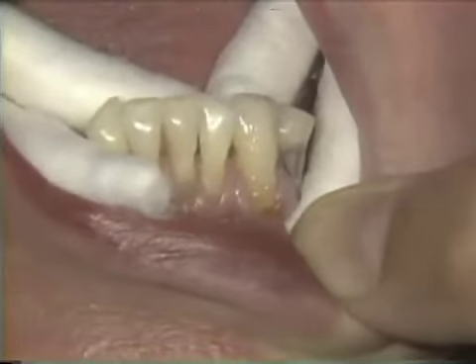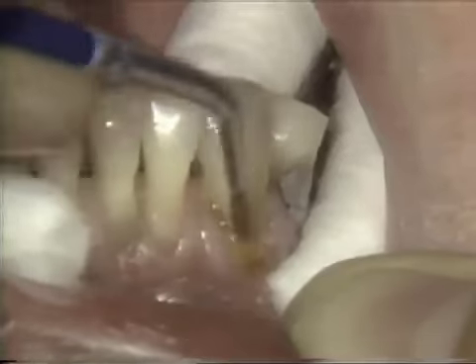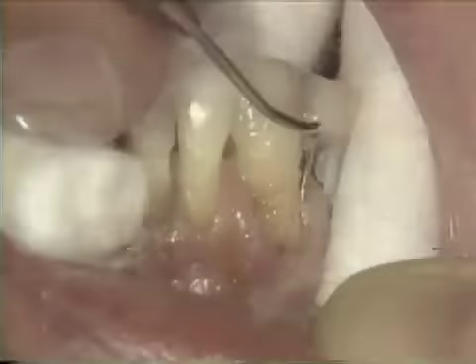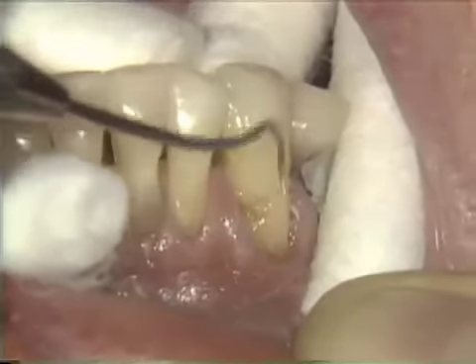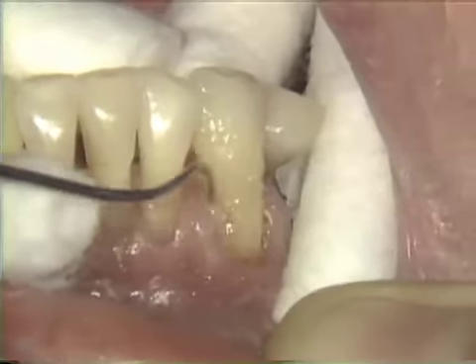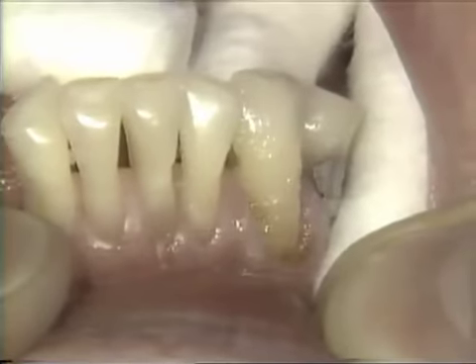Yellow-orange tint is applied and light cured. Brown tint is then applied and light cured. Dark yellow composite is then applied in a thin layer and cured. As you can see, a close color match has been achieved.